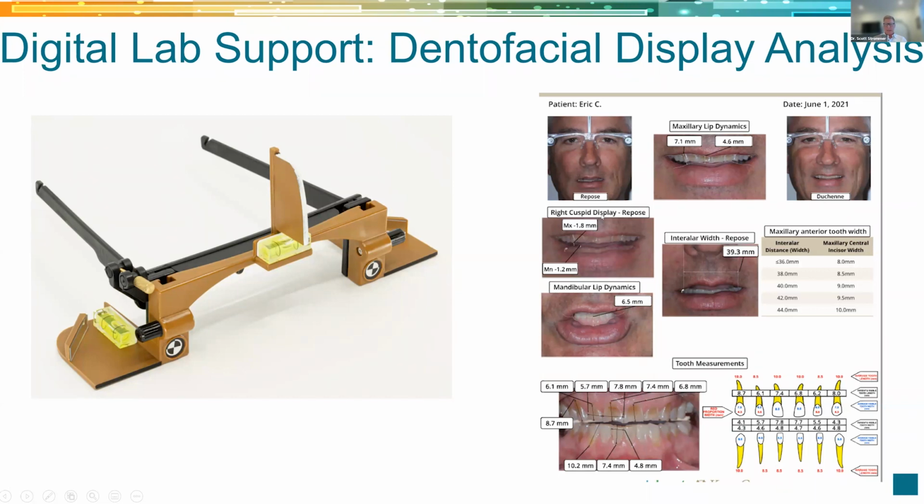When those are in place and we have a nice SLR photo of the patient, we can come up with some really nice data. These fins are used to be leveled in the face, so we can make sure that the twist and the tilt and the tip of the head has been managed. All those things that I'm sure many of us didn't enjoy doing when we're trying to take a face bow, and they always came back mounted steep like this. When we end up doing our smile designs, we want these to fit in the patient's face. And this just happens to be one of the easier ways I've found to do this.